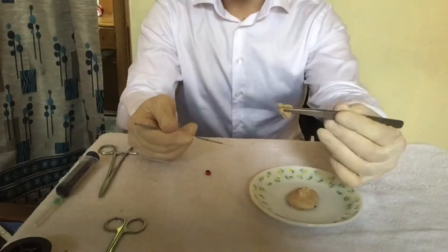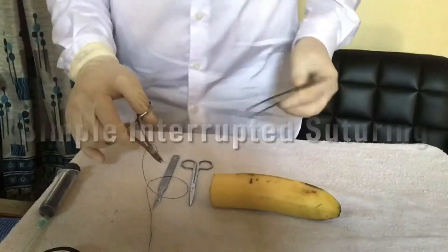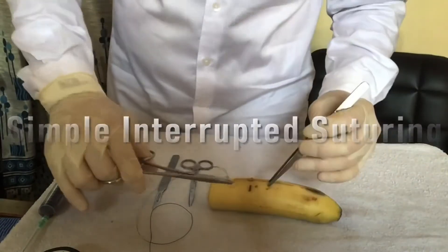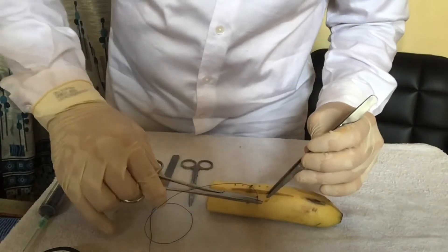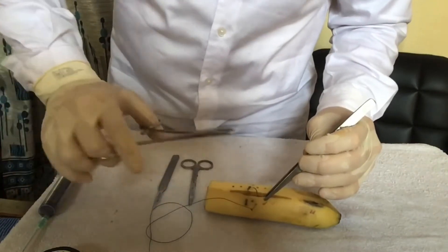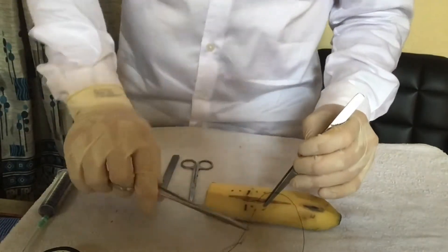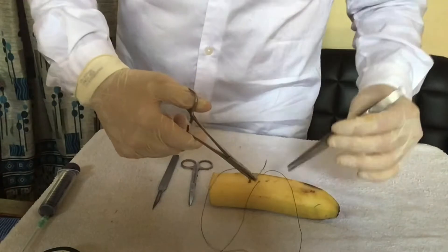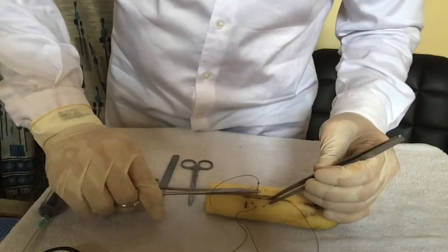For simple interrupted suture, hold the needle with a needle holder and insert the needle 90 degrees perpendicular to the skin. Bring it out from the site of incision through subcutaneous tissue. Now insert the needle subcutaneously on the other side and pull it out as shown.